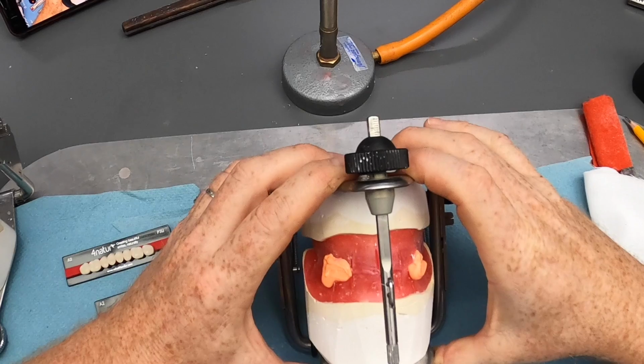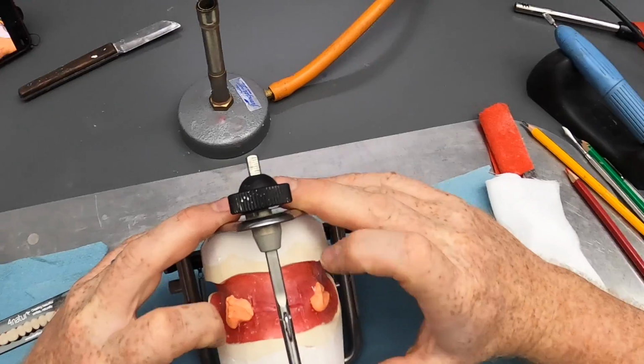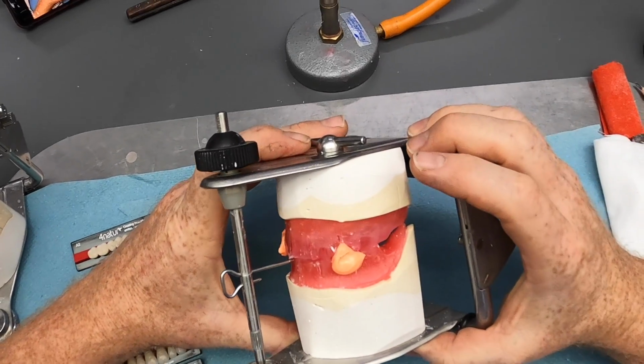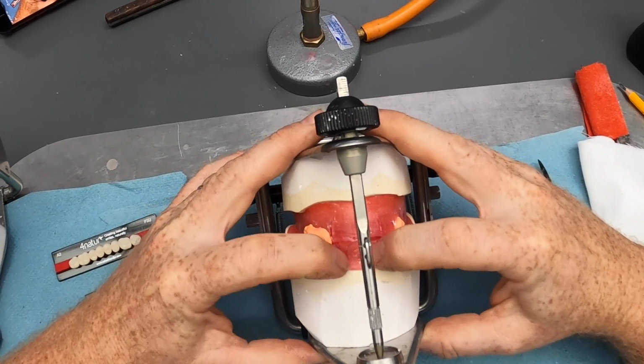So we're going to use that information to position our teeth, starting from the midline, working round to the canines, and then I'm going to position the lower anterior teeth. If you watched the other video that I did on setting up teeth some time ago, you'll see that I started at the midline, worked all the way around to the 6s, dropped down to the lower 6s and worked all the way forward.